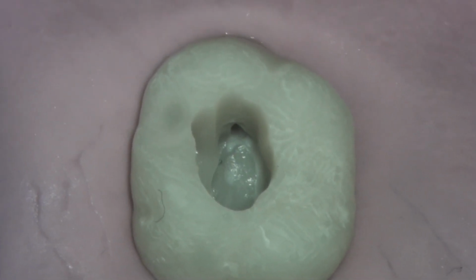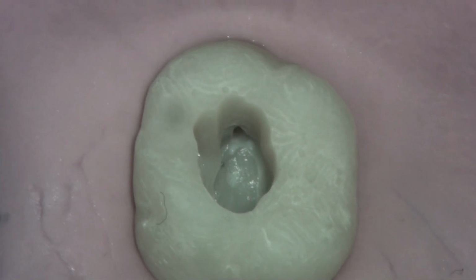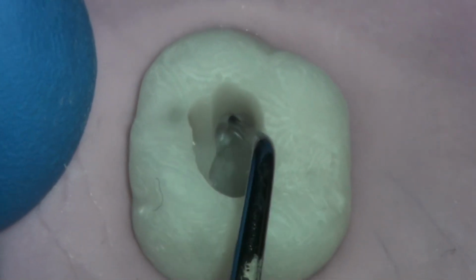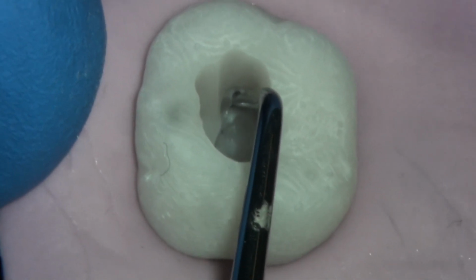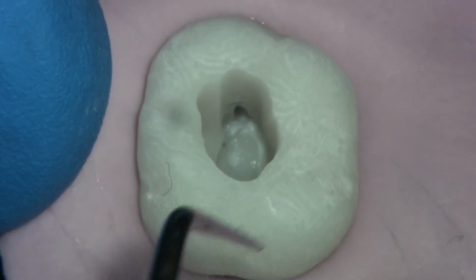So we now need to consider the instrumentation of our simulated tooth, and most particularly the instrumentation of the second mesiobuccal canal. An endodontic access cavity has been created, and this has been artificially flared here to the mesial so that you are actually able to see into the floor of the pulp chamber, and we identify with our DG16 probe our MB1 canal.